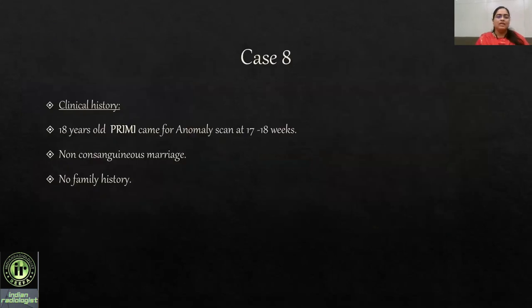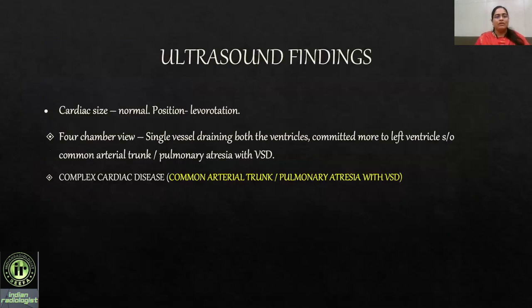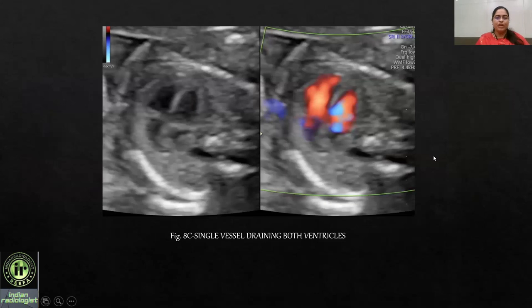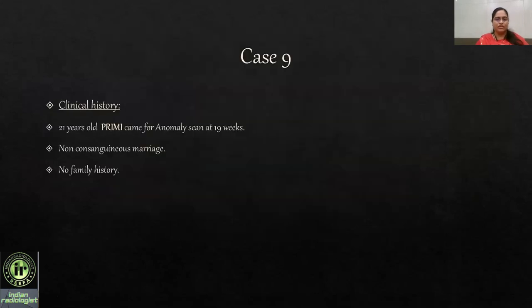Case 8: An 18-year-old primigravida came at 17-18 weeks for an early anomaly scan. Non-consanguineous marriage, no significant family history. A single vessel was seen overriding both ventricles, committed more to the left ventricle, consistent with common arterial trunk or pulmonary atresia with VSD. Color flow confirmed only a single vessel overriding both ventricles.